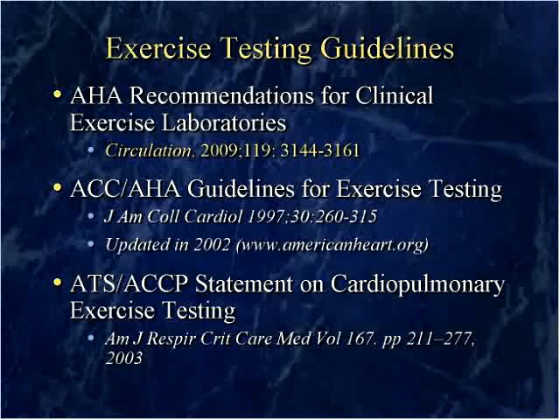Well, as we talk about exercise testing, we look at where the recommendations come from as far as how we do that particular test. Many of the professional organizations out there have put out recommendations or guidelines related to exercise testing. The American Heart Association has a recommendation that they published for the clinical exercise laboratory in Circulation of 2009. The American College of Cardiology and the American Heart Association have a joint guideline that was updated in 2002, and the ATS and the ACCP, the American College of Chest Physicians, have a statement on cardiopulmonary exercise testing that was published in 2003.